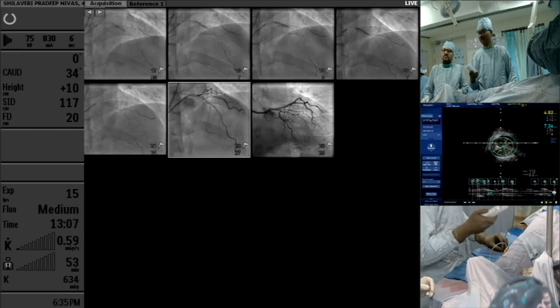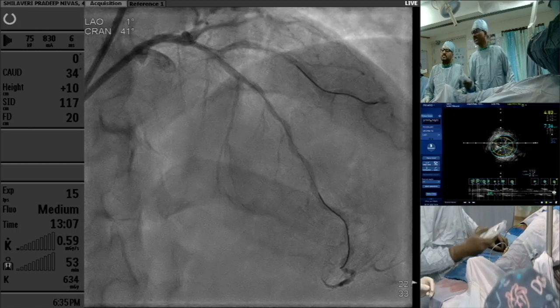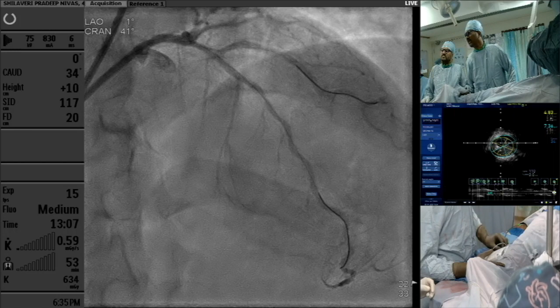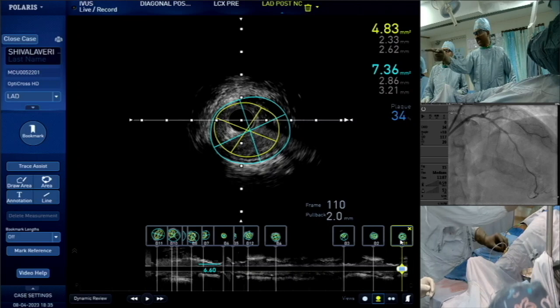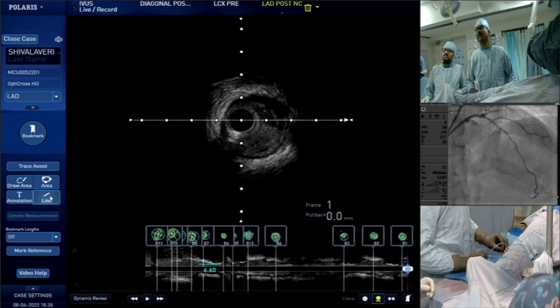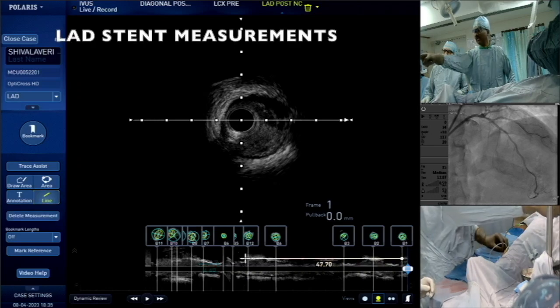Okay. We can take a. What is the size? You can take 2.5 comfortably, sir. 2.8, 3.2, around 3 you are getting. So I think we can take even 2.5 as well. What is the length? Length below the diagonal. You take up to diagonal, what is the length? So you can see the diagonal at B5. Okay. Yeah, stop there. I think it's 48.